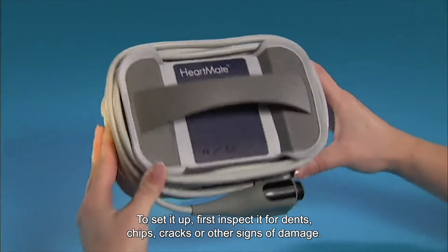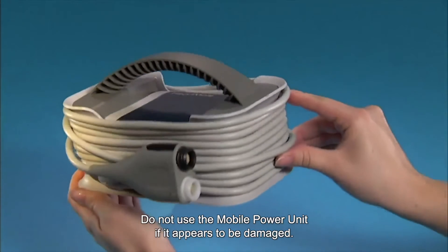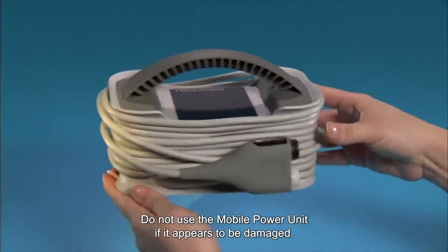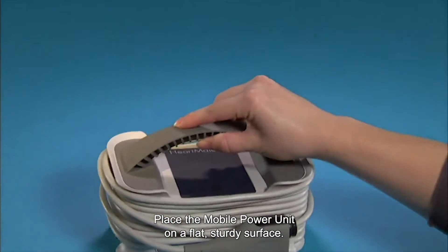To set it up, first inspect it for dents, chips, cracks, or other signs of damage. Do not use the mobile power unit if it appears to be damaged. Place the mobile power unit on a flat, sturdy surface.